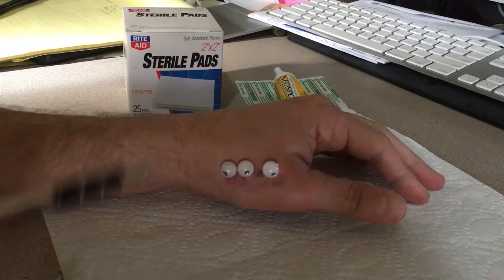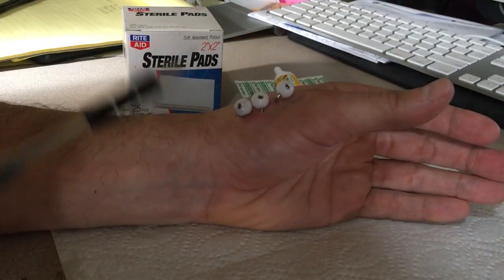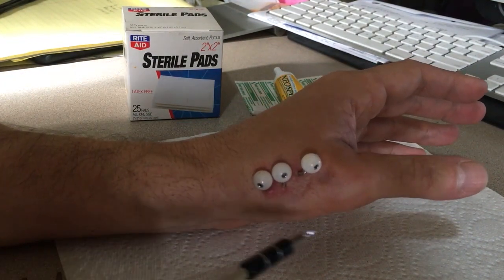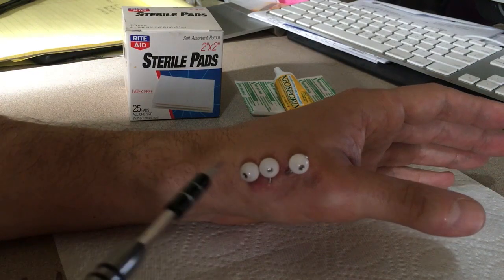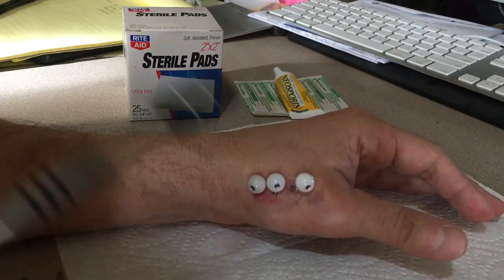Today I am going to remove the pins that I have had in my thumb for the past few weeks due to a broken phalanx at the bottom. This setup is actually pretty standard from what I've seen and read as far as the three pin setup.